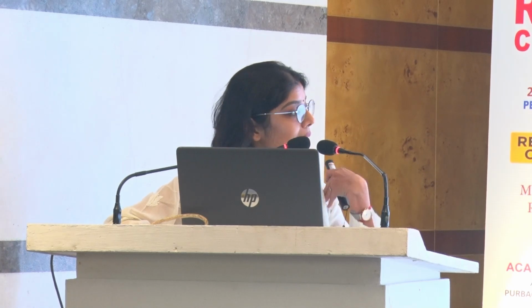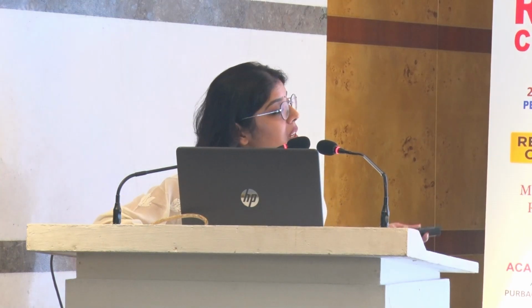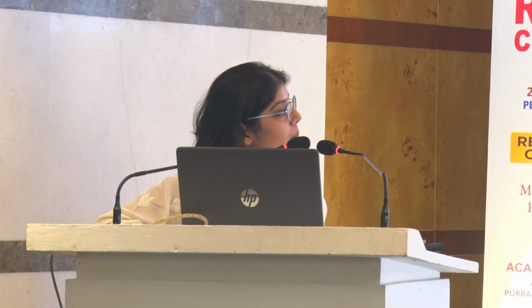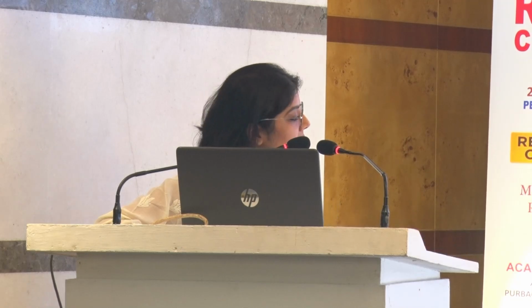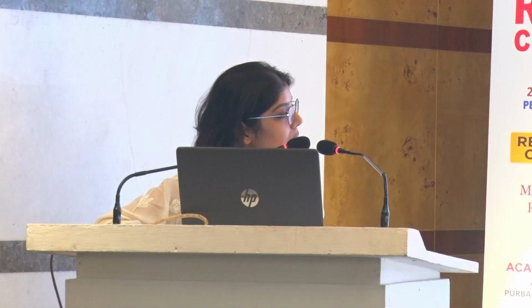Shoulder joint is slightly difficult for beginners, as we discussed previously, because of multiple scanning planes and dynamic maneuvers. But we can diagnose tendinitis, bursitis, effusions, tears on shoulder ultrasound. Just covering one case. This is the short axis view of the biceps tendon, where we can see fluid surrounding it with a lot of vascularity. We ended up injecting this case.